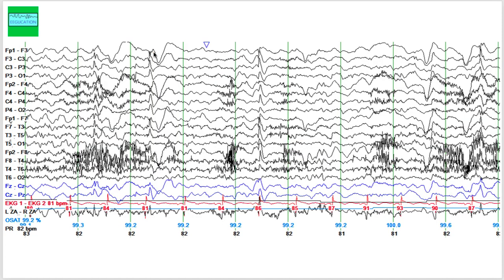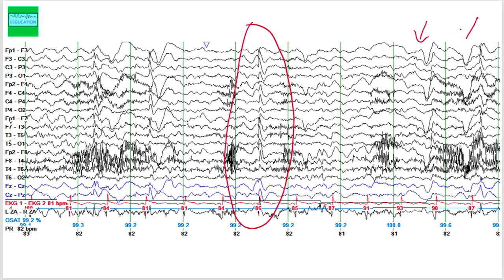Moving on, we start seeing some generalized sharp waves. You can appreciate generalized sharp waves seen in multiple locations. The patient is still awake — you can see the eye blink and muscle artifacts. During wakefulness, there is a lateralized sharp wave in the left temporal head region, another in the right temporal head region, and then generalized sharp waves. While looking at the EEG, it is also extremely important to keep an eye on the heart rate — describe it as a range, including the lowest, the highest, and whether it is regular or irregular.